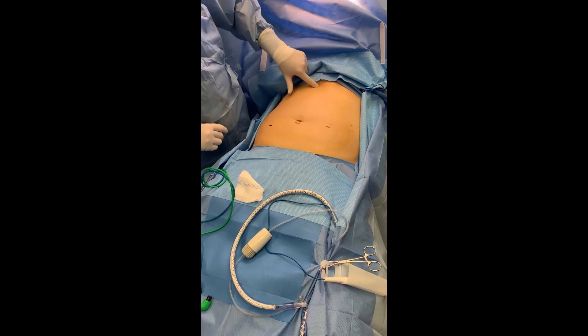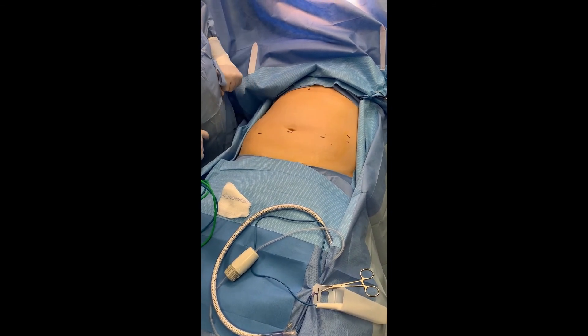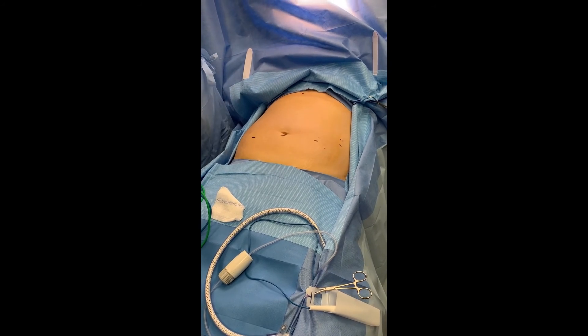And of course, I'll put my Nathanson retractor here through a 5 millimeter laparoscopic trocar. That usually works for my port placement.